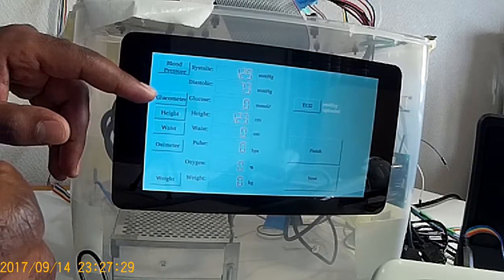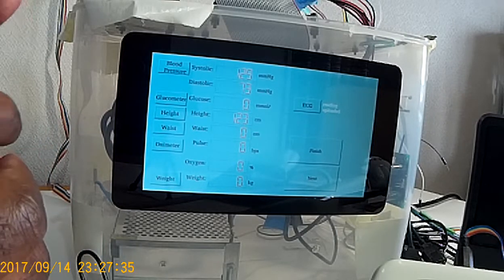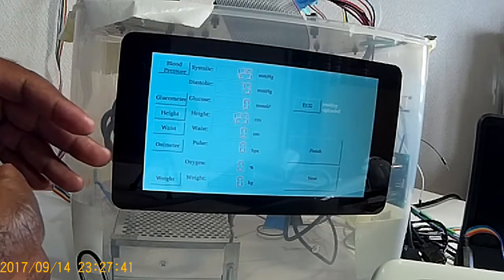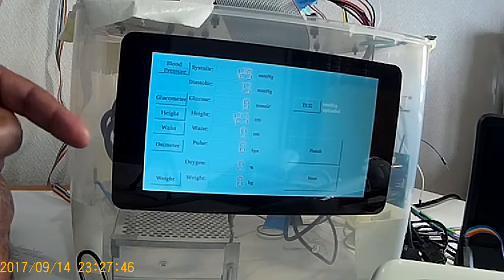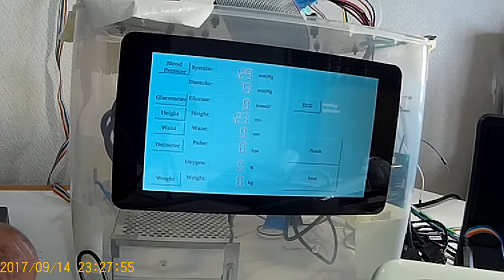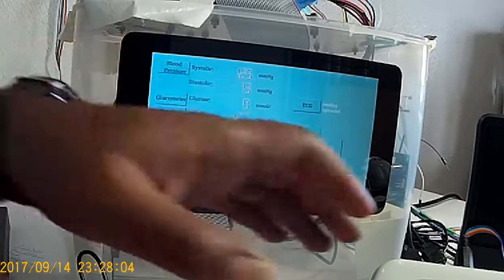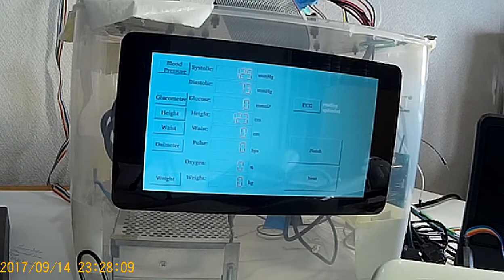And the glucometer will help us identify the issue of diabetes. In the future, cholesterol will be built into this EHealth kiosk. That's also one of the most important medical devices which is supposed to be incorporated in this work. But for some reason, due to the high cost of the type of cholesterol device with data output into a PC, it's not much within the budget we have.